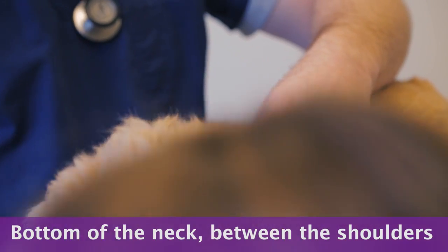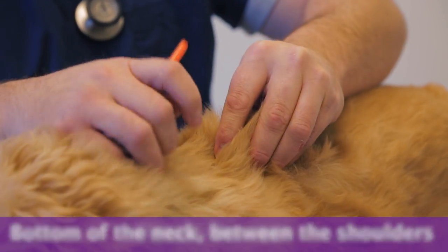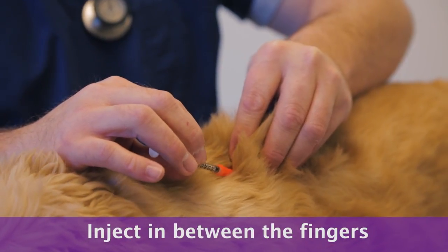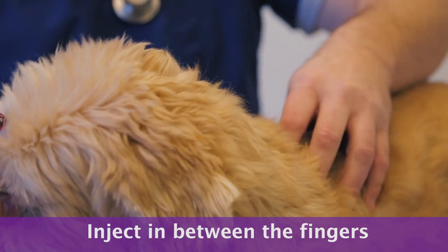In general, I give the insulin injections between the shoulder blades, which is basically at the bottom of that neck, in that area where we can grab a little bit of skin to elevate it up. I'm going to basically inject either underneath my index finger or between my index and my middle finger.